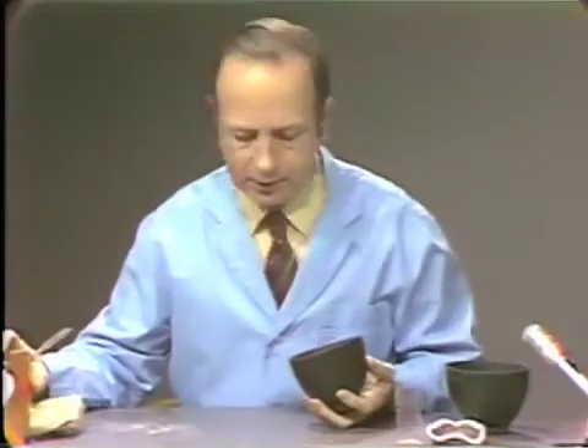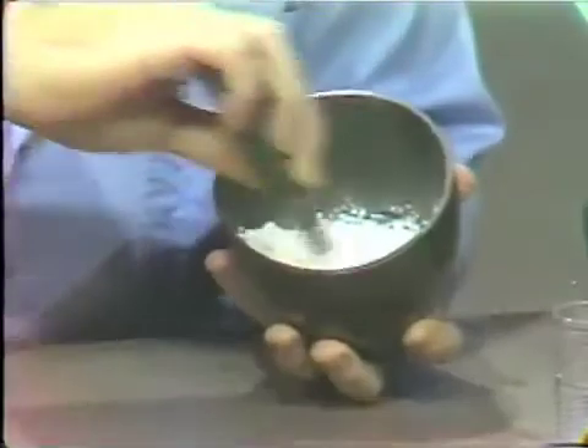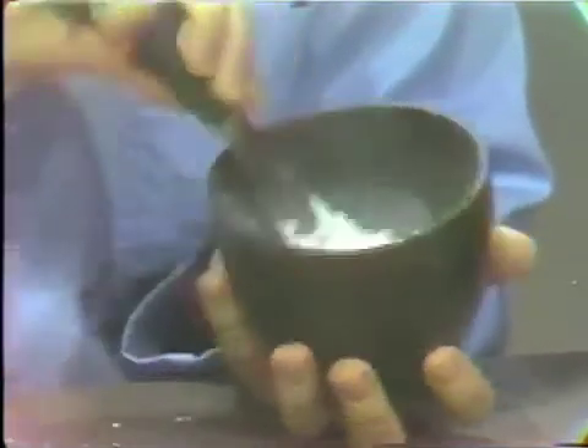Now we will start the stopwatch because this particular mix should be mixed for one full minute. Initially we are simply only trying to wet the powder. Once the powder has been wet, we use essentially a stropping action to thoroughly mix this material. It will seem rather stiff at first, but it will become less viscous as you continue. One minute seems like a long time to mix, so you should check your initial mixes with a stopwatch to be sure you are mixing one full minute.